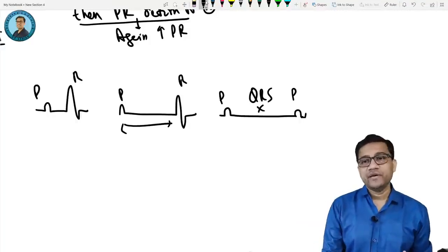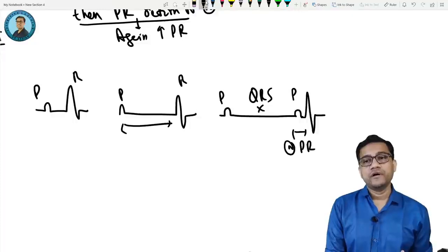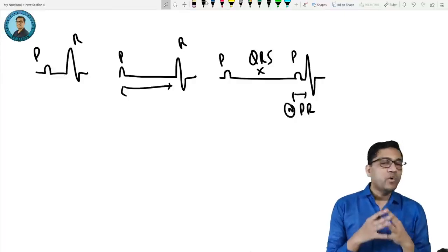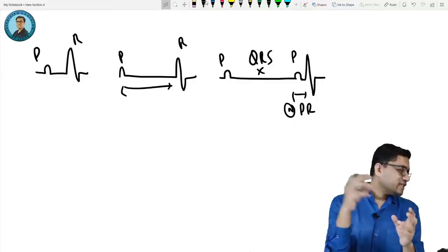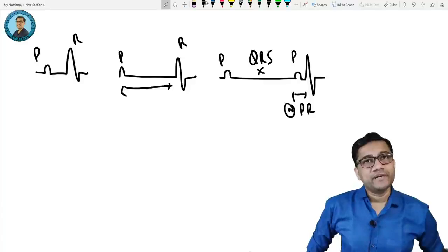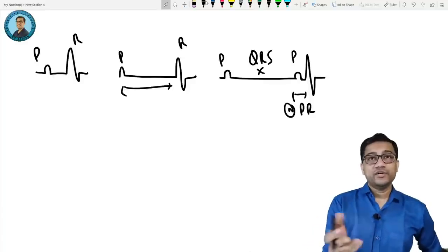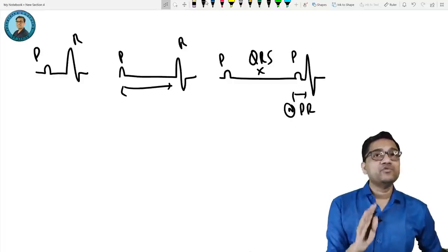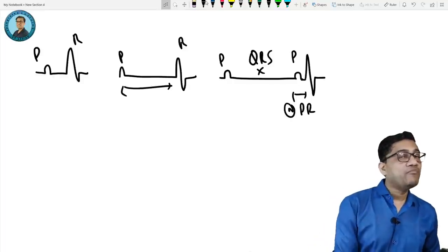And now next time the husband comes on time, so it becomes normal PR. Are you clear? This is Mobitz 1. PR keeps increasing, then there is a missing beat. And what is the wife saying? If you don't come back, I will beat you. So what is the other name of Mobitz 1?